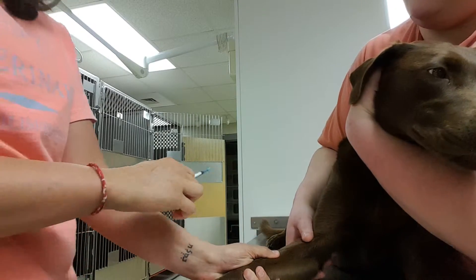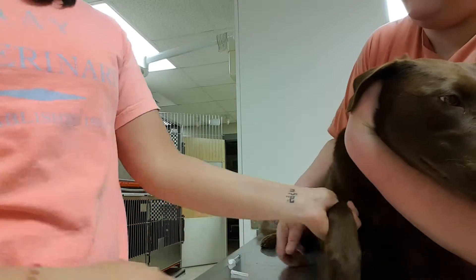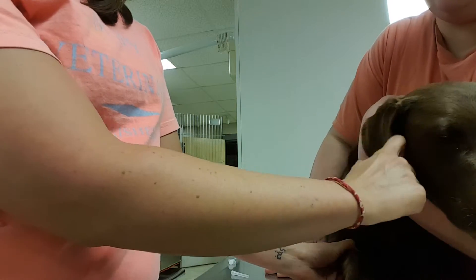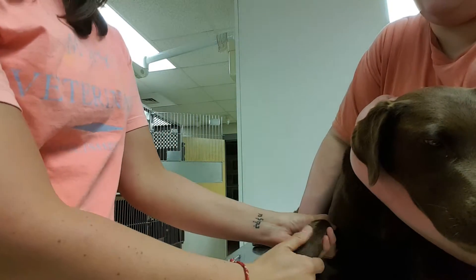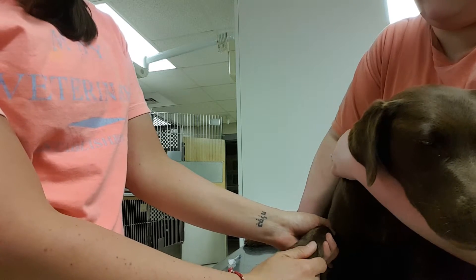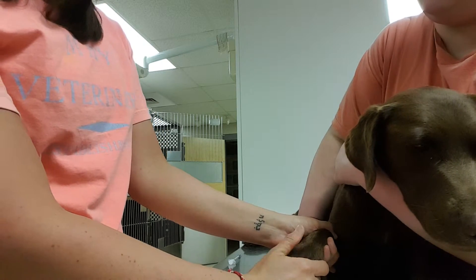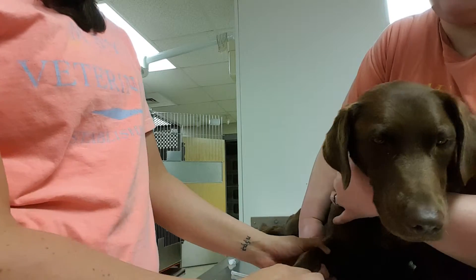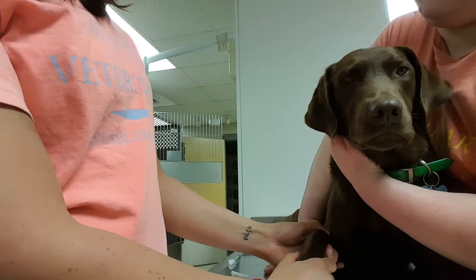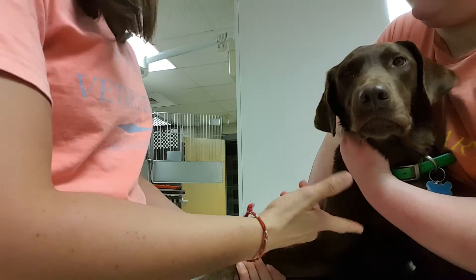Alright, now I'll retract my needle and hold that off until hemostasis occurs. And once that occurs, I'll just make sure there was no excess bleeding, and if there is, I'll just clean that off. Thank you very much.